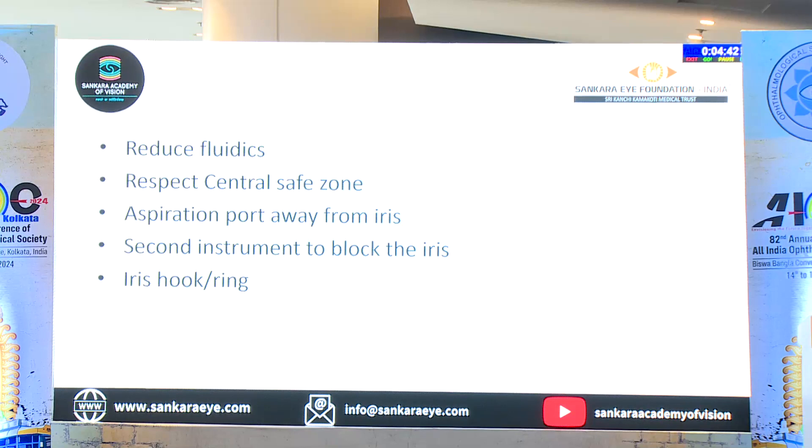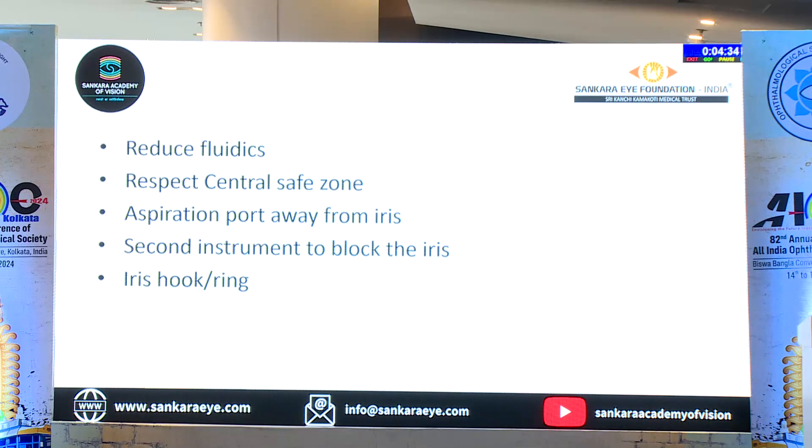So what do we need to do? We need to reduce the fluidics the moment you have that, ensure that you respect the central safe zone, and keep the aspiration port away from the iris. You can use the second instrument, but as beginners it becomes tough — then iris hooks or some rings might definitely be of some help for you.